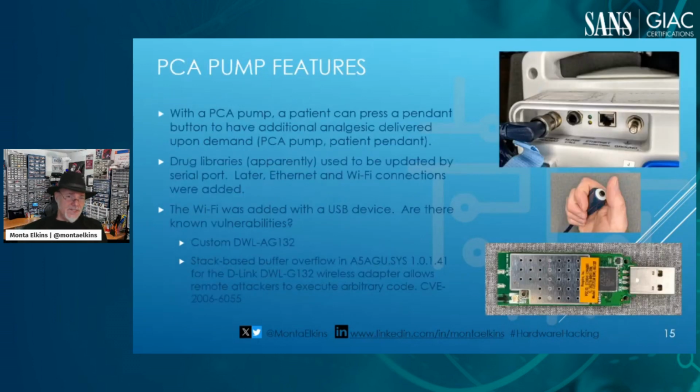Okay, so we've talked about this PCA pump. You push the button and you get some of the drug that's delivered. What are some of our vulnerabilities? Oh, one more that I found is that inside here it has almost a commodity USB connector. It looked like there used to be a serial only connection, and they added some Ethernet and wireless USB Wi-Fi connector.